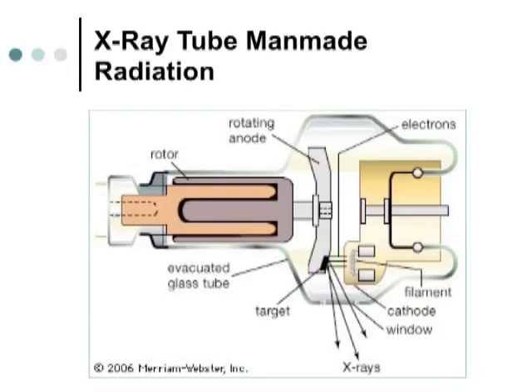And there's actually two separate circuits. One that produces high voltage. We have step-up transformers that do that. And then one that produces low voltage and high amperes to heat the filament up. The problem with the older tubes, back in Roentgen's day, is by the time you stepped your voltage up high enough that you could produce X-rays, you didn't have enough current left over. You step your voltage up 1,000 times, your current is going to decrease 1,000 times, and that's why we use KVP and MA, milliamperes. Whereas a normal circuit runs on volts and amps, right?